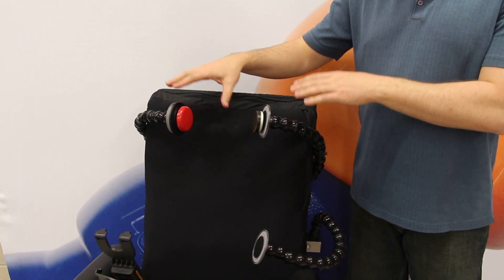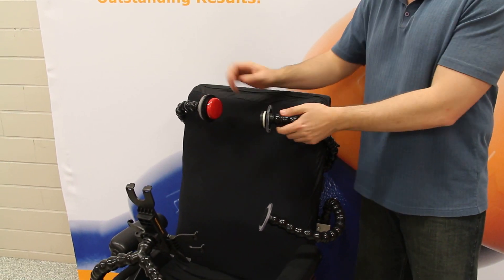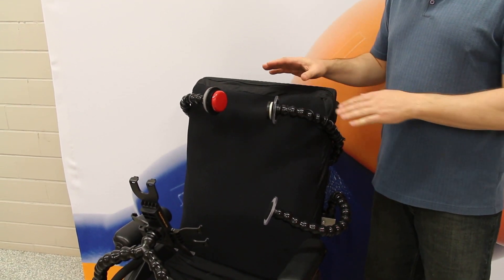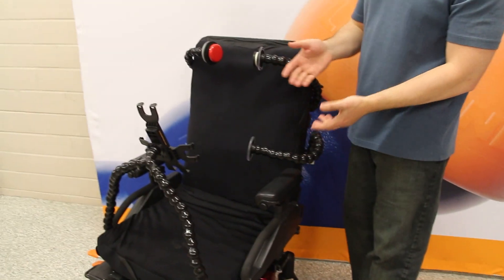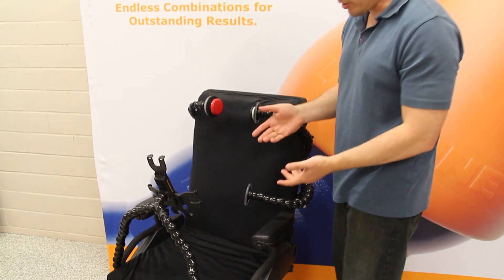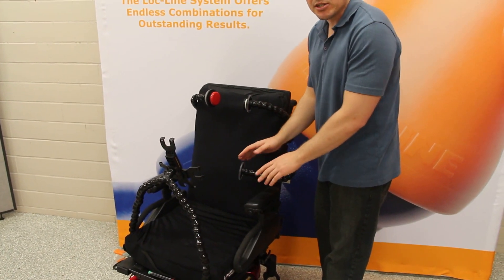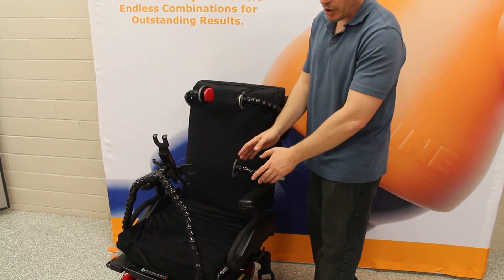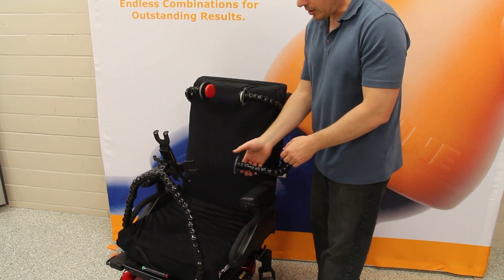The nice thing is if you do a lot of assessments, or if you need to fine-position the lockline right where someone needs it, it works really well for that. If you're doing an assessment and discover that a head switch is not going to work for somebody, you can mount it in different places on the chair to use it as an elbow switch, a knee switch, or even just for holding a device.